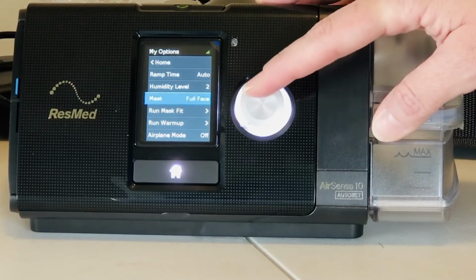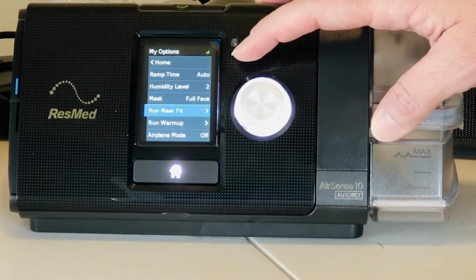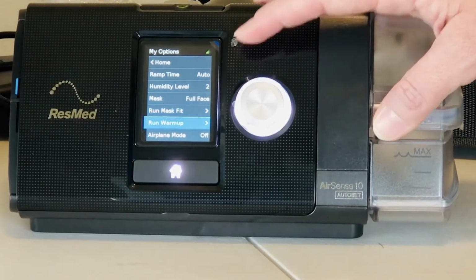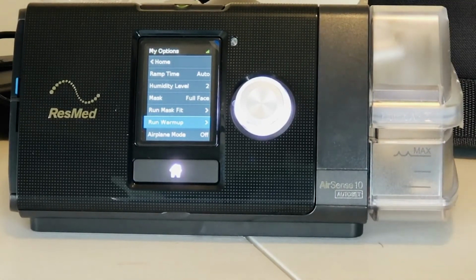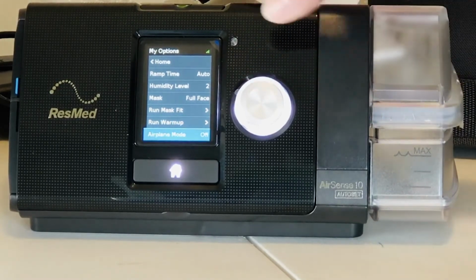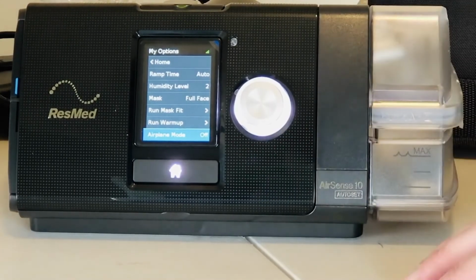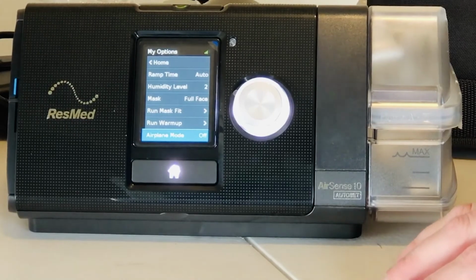This is where you can dial in what mask you're using. The machine has a run mask fit option that will test for leaks. Machine has a run warm up feature where the plate will start to heat before turning CPAP on to preheat the unit. And because this device has its own cellular signal, you would set this to airplane mode if you had this connected to a power source on an airplane.